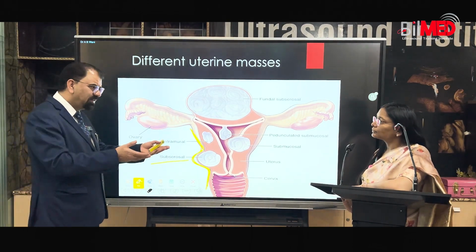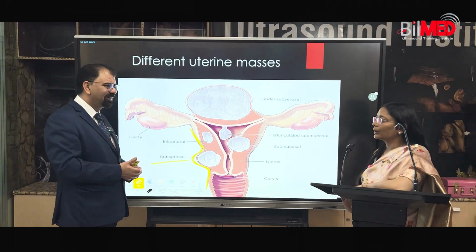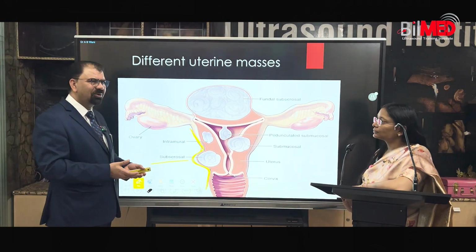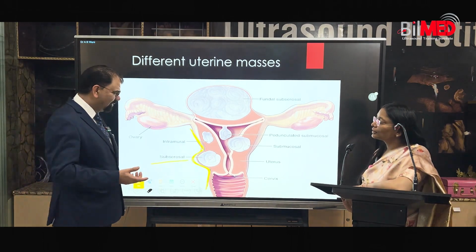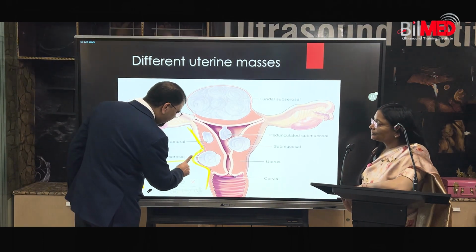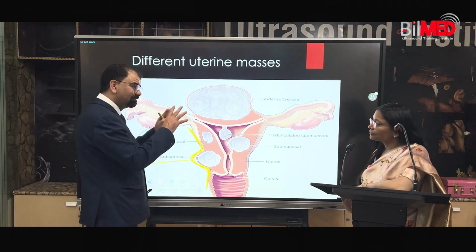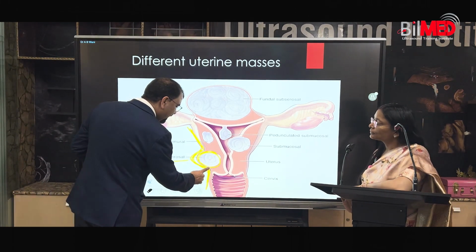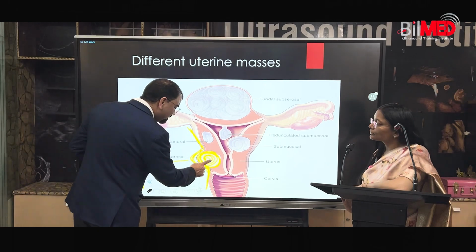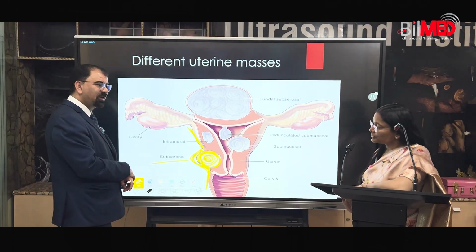maybe that you are having a very low-end machine, or maybe that you are not very trained to get these fibroids. What I am saying you, if you see a distorted contour of the uterus, most probably you are dealing with a fibroid. And which fibroid? Subserosal fibroid.